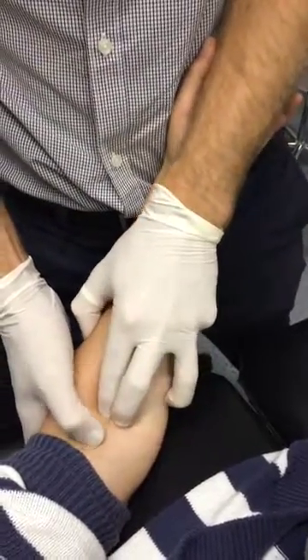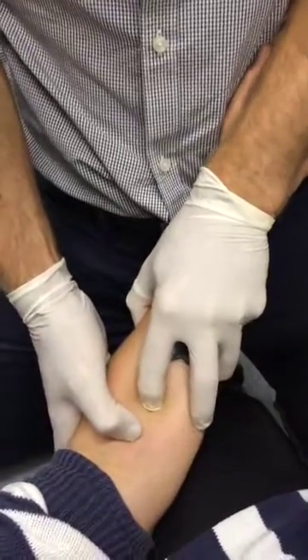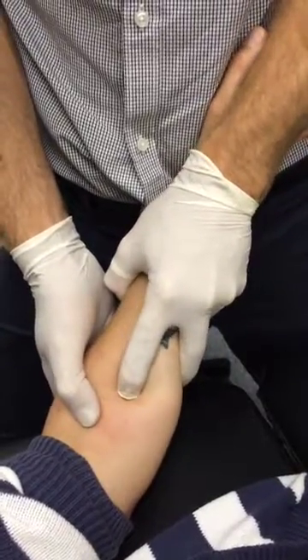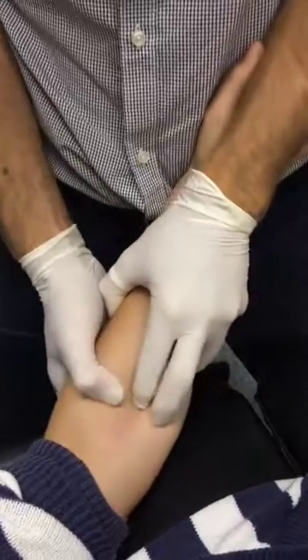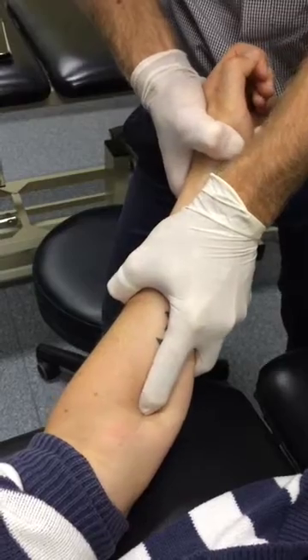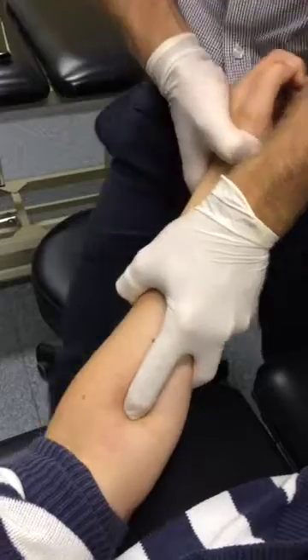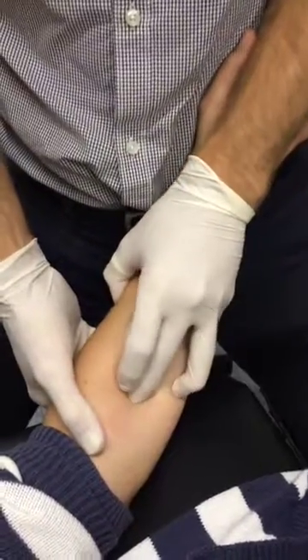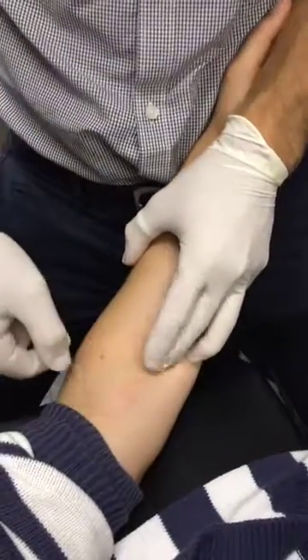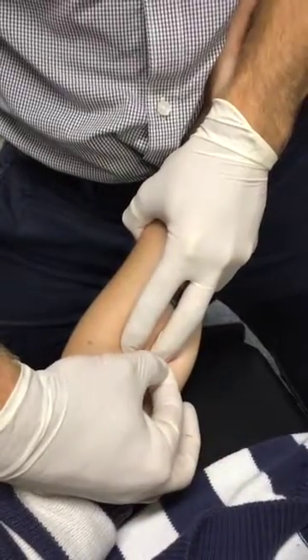There we are. So then once you're on it, we can go down. It's pretty tight there, so let's make sure that's not pronator — just pronate for me. That was pronator. So what we do with this one is we needle at the radius. I tend to isolate it there and then needle laterally.